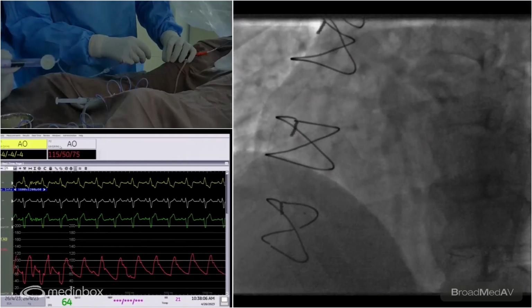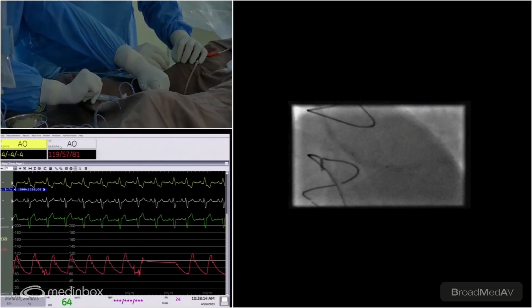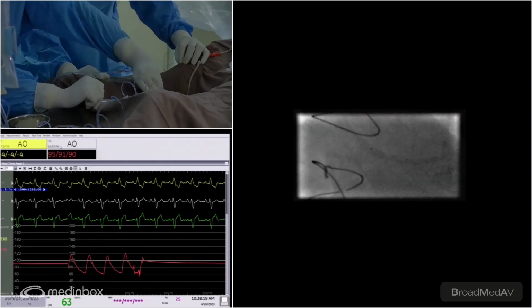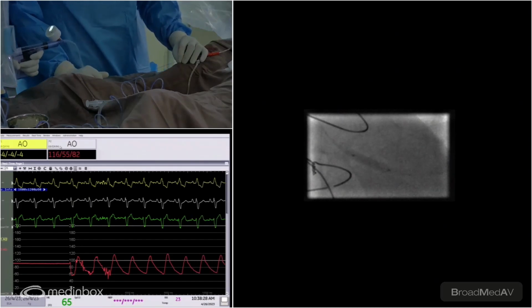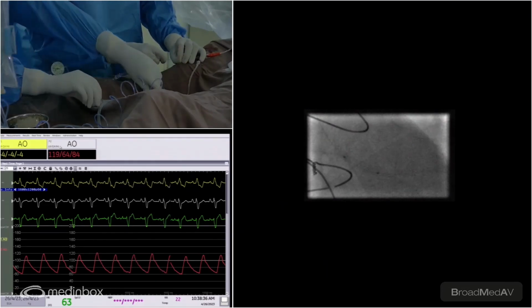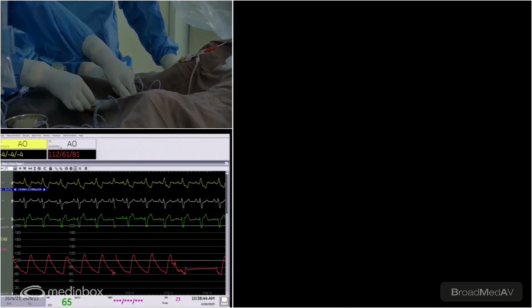Okay, so that's a 3.5 balloon, and I'm just going to do another. Get the filters in, please. Okay, small check. We need to be within the graft all the time here for the 3.5. We'll dilate here, and for the proximal we'll use a stent boost. Okay, go up here, please. 8, 9, 10, 11, 12, 13, 14, 15, 16. All right, it's well expanded post dilatation with the 3.5. So now I'm going to do the proximal edge. Let's do the stent boost to visualize proximal optimization.